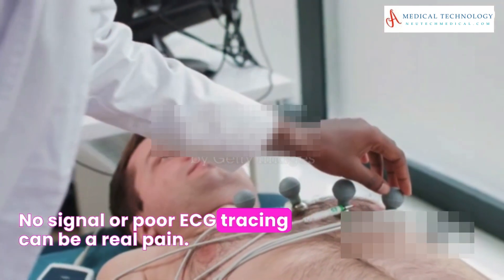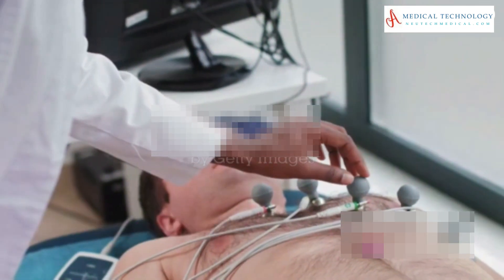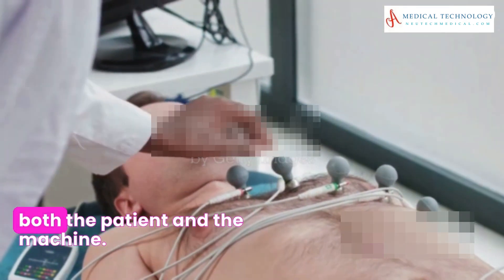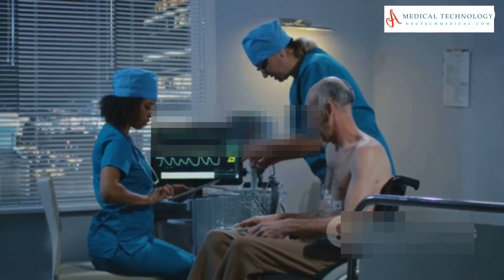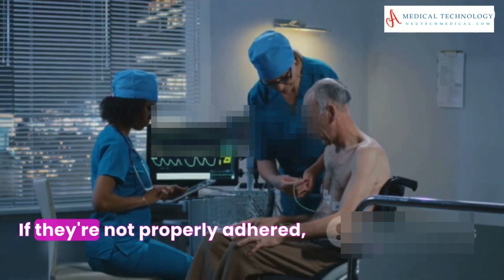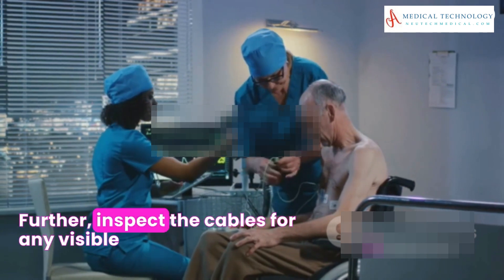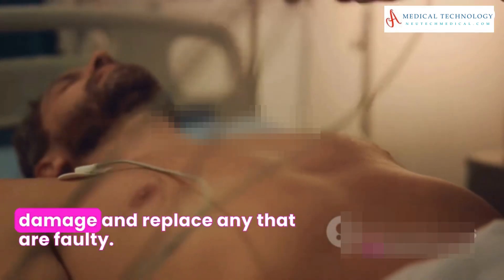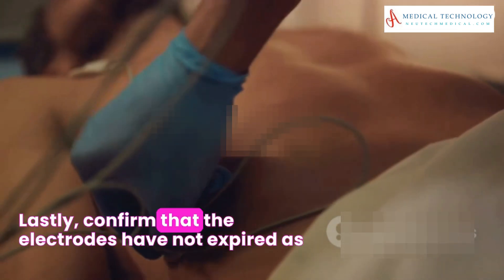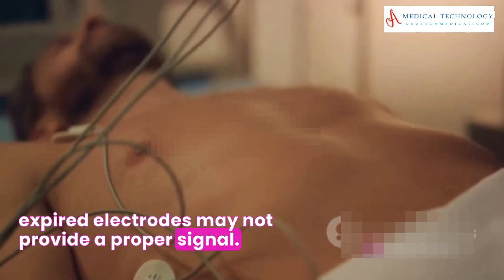No signal or poor ECG tracing can be a real pain, especially when you're dealing with a critical situation. First, ensure that the electrode cables are securely connected to both the patient and the machine. Second, check the electrode's skin contact — if they're not properly adhered, reposition or replace them. Inspect the cables for any visible damage and replace any that are faulty. Confirm that the electrodes have not expired, as expired electrodes may not provide a proper signal.